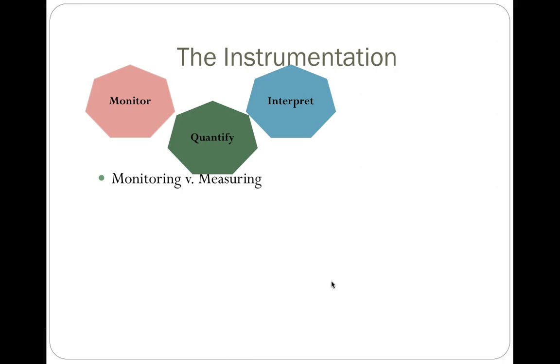The reading should be a convenient indication of the physiological process, but it's really important to understand that it's not the process itself. So when we're talking about measuring electrical activity in the muscle, that's what we're doing. We're measuring electrical activity. We are not measuring strength of the muscle contraction. Though we can make inference that if we have increased electrical activity, that means more motor neurons being stimulated, which then should mean increased strength. So we make those interpretations, right?